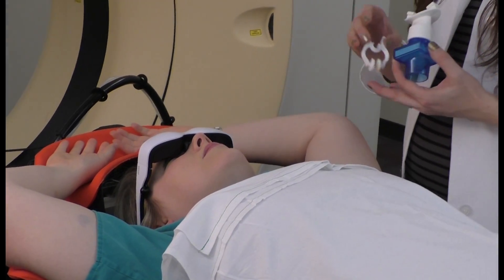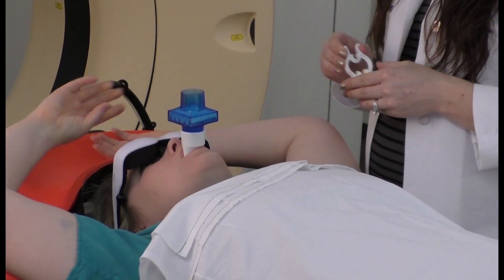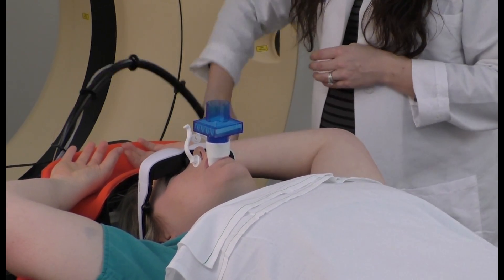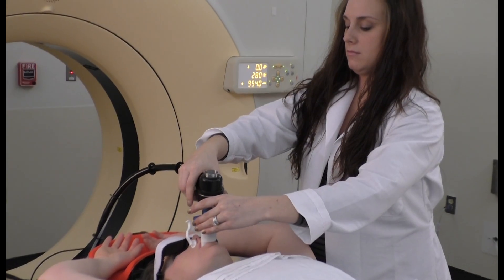Let's put it all together: the adjustable goggles, the mouthpiece and filter, and the nose clips. Your therapist will now connect you to the SDX sensor. At all times, you remain in complete control of your breathing.